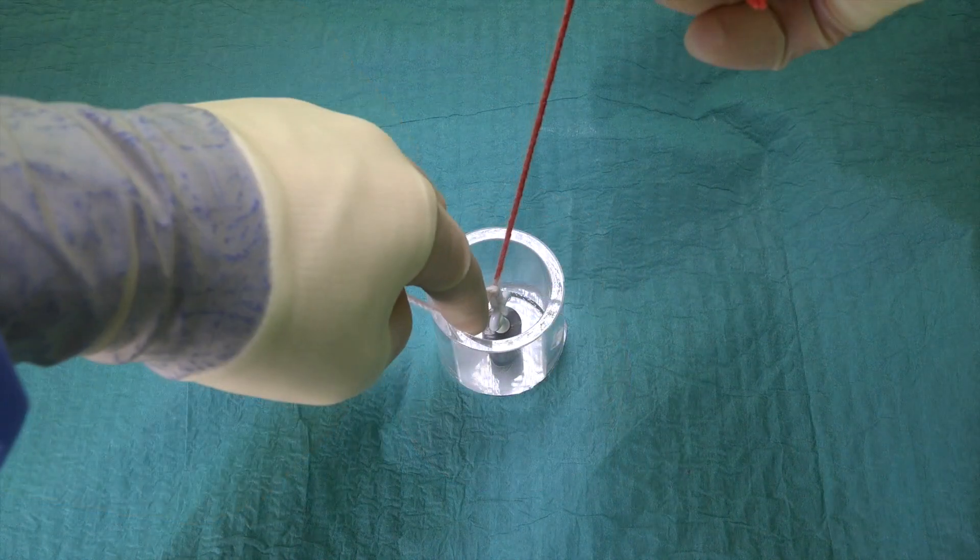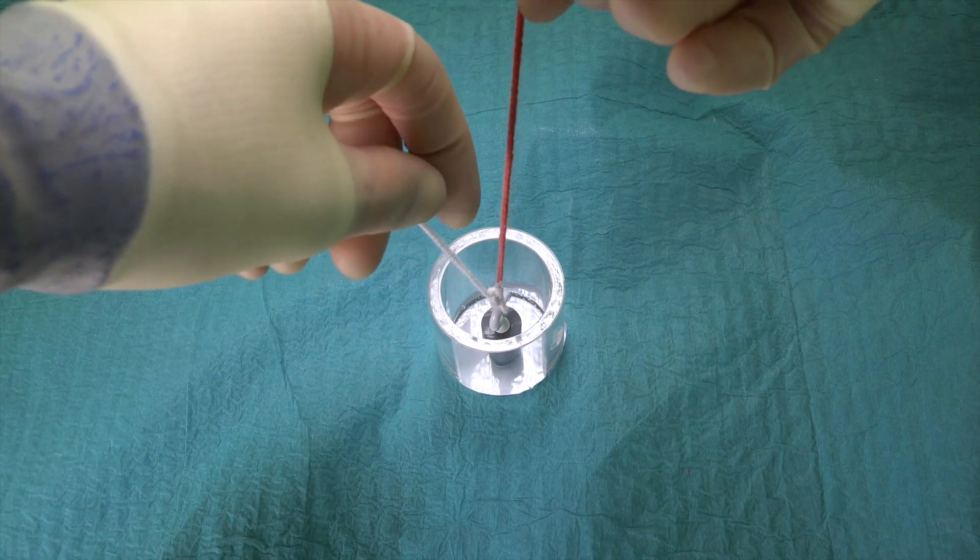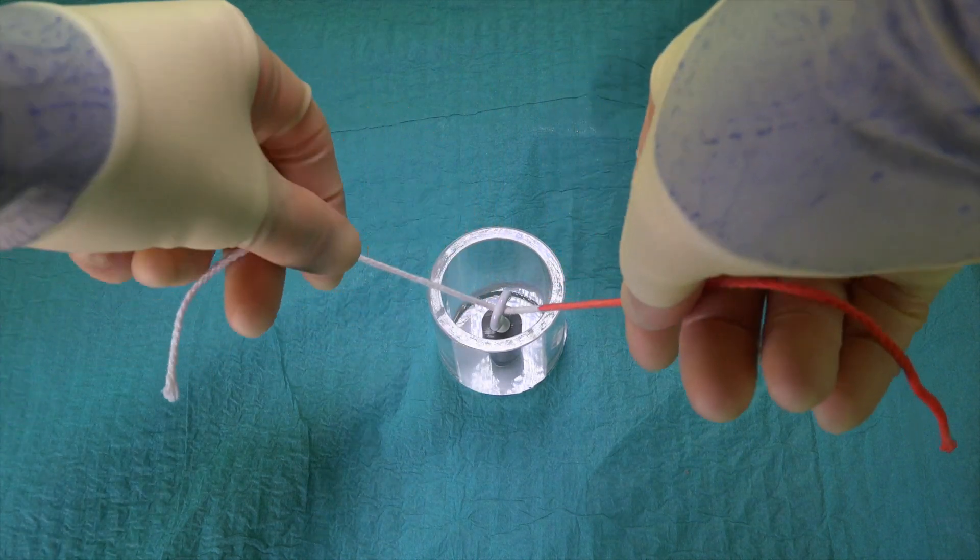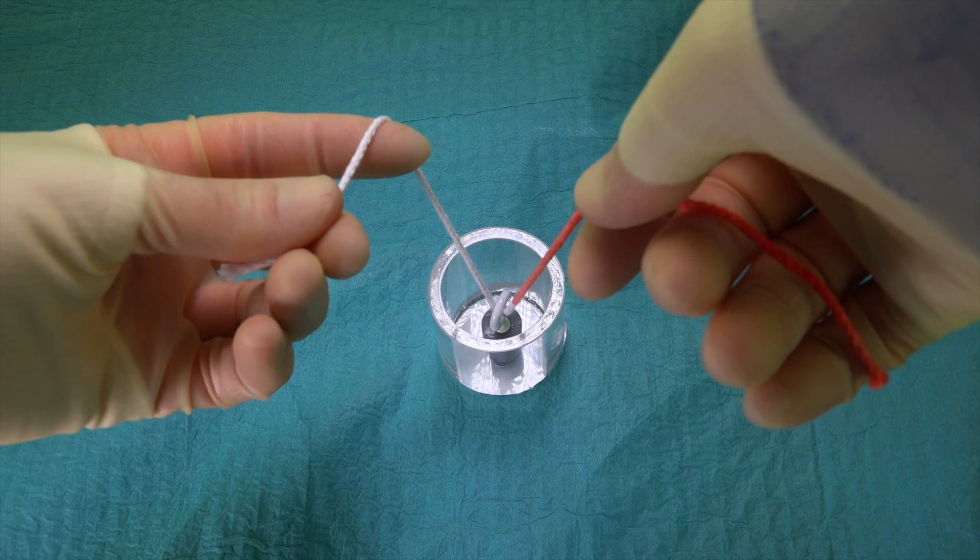Obviously, more throws will be required when using slippy monofilament sutures, as opposed to the more grippy braided sutures. So let's take another look at hand tying at depth with the left hand.